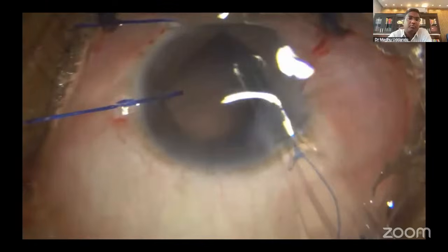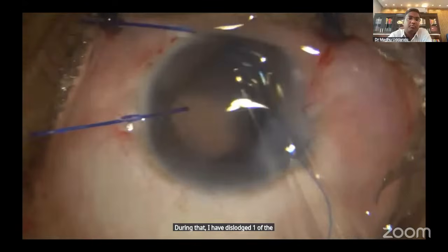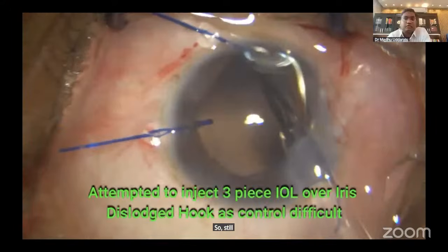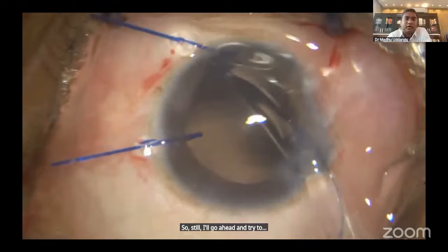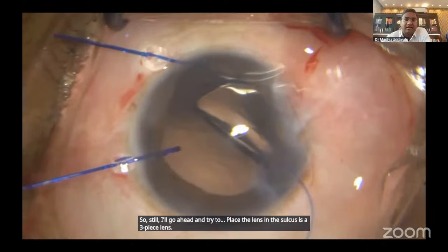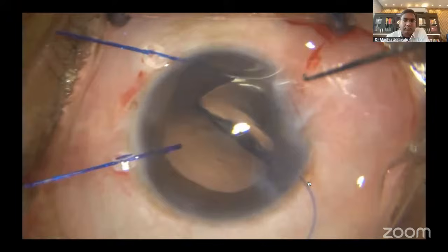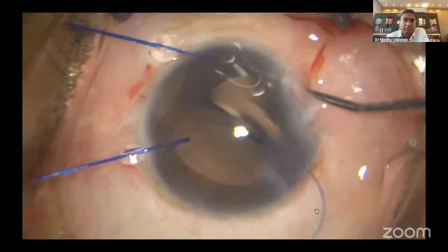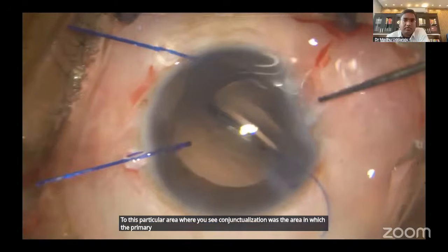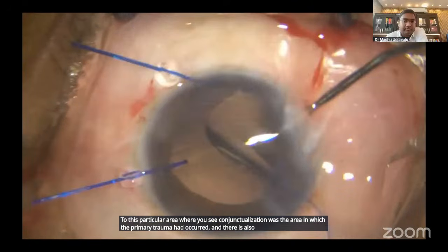During that, I have dislodged one of the iris hooks, so I can't do an optic capture. So still, I'll go ahead and try to place the lens in the sulcus. This is a 3-piece lens. So this particular area where you see conjunctivalization was the area in which the primary trauma had occurred, and there is also some synechiae there.